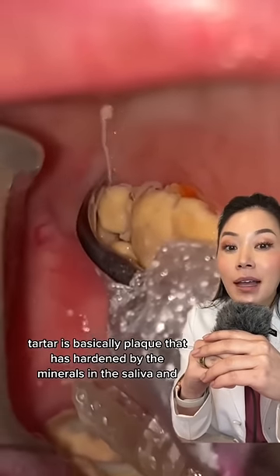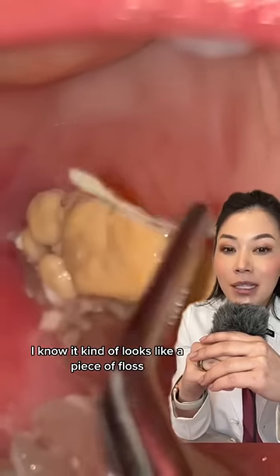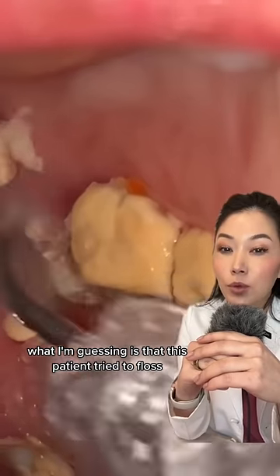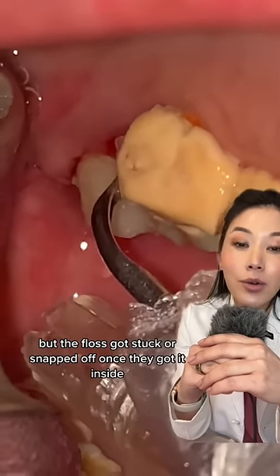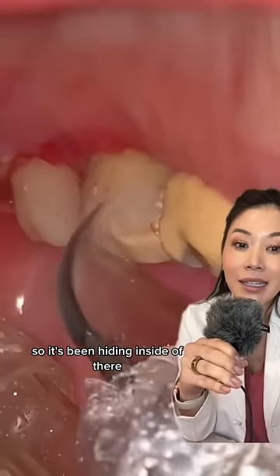They have found what kind of looks like a piece of floss. My guess is that this patient tried to floss but the floss got stuck or snapped off once they got it inside, and they couldn't get it fully out — so it's been hiding in there.